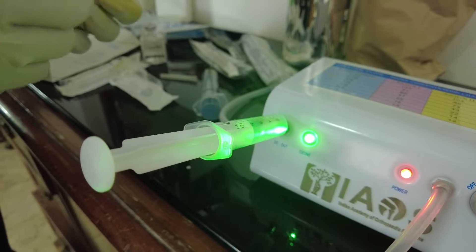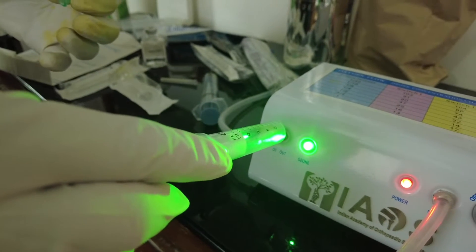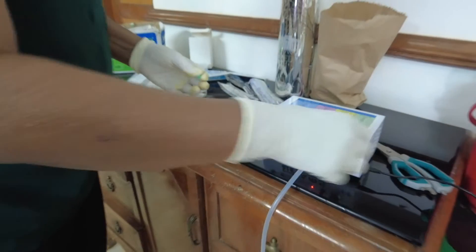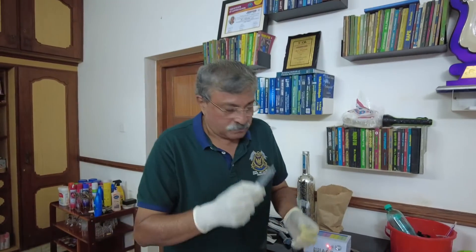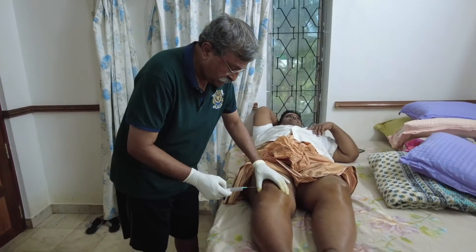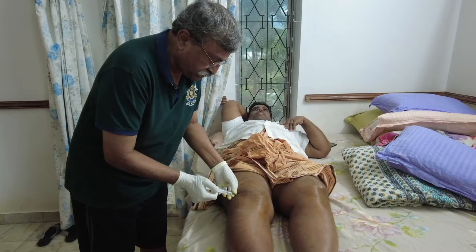I need only 10 ml of ozone gas, which is 5 ml per knee joint. Once the amount is received in the syringe, I just take a small whiff to confirm it is a good concentration of ozone, and then 5 ml is injected into the right knee.